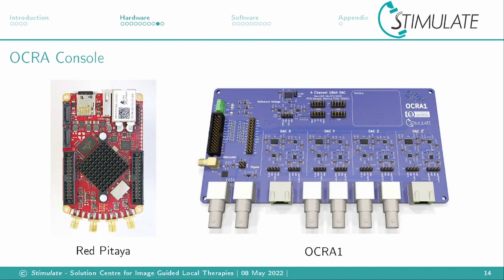The console contains two major components: the commercially available microcontroller FPGA Red Pitaya that handles the RF signals. It has two transmit and two receive channels with a sampling rate of 125 megasamples a second to allow MR signals up to 40 MHz. It also has GPIO pins where we provide a SPI signal to control external hardware.